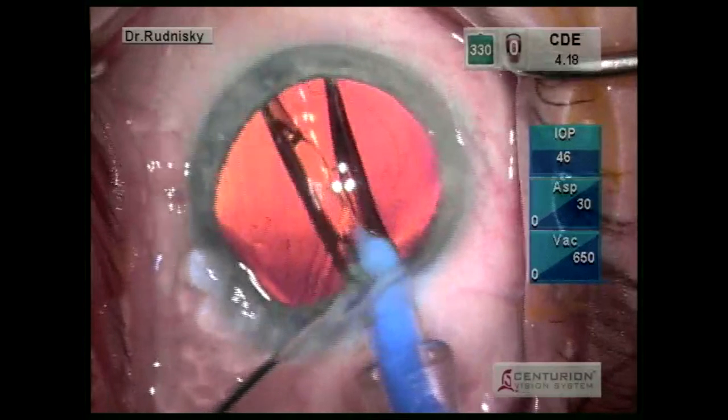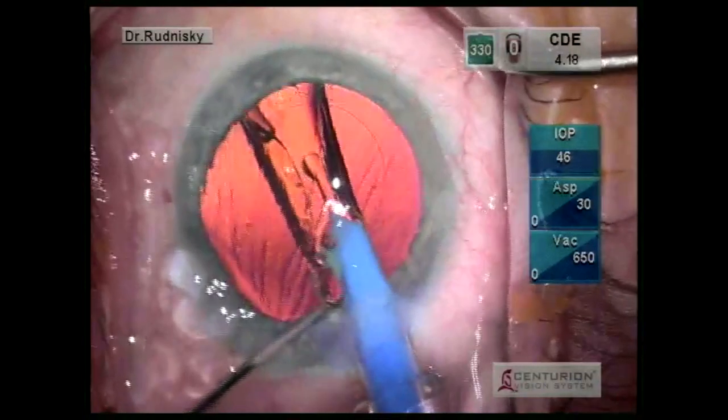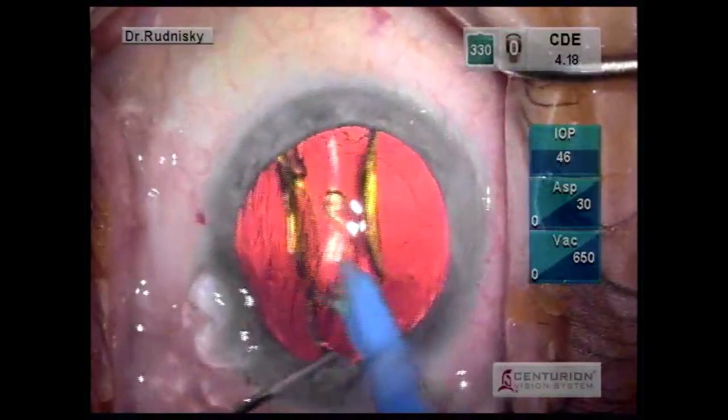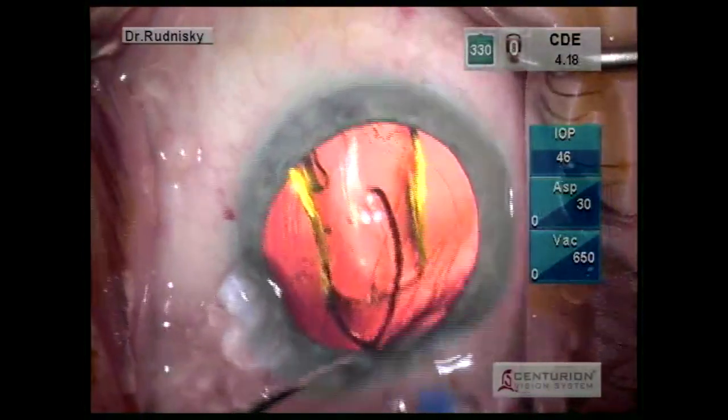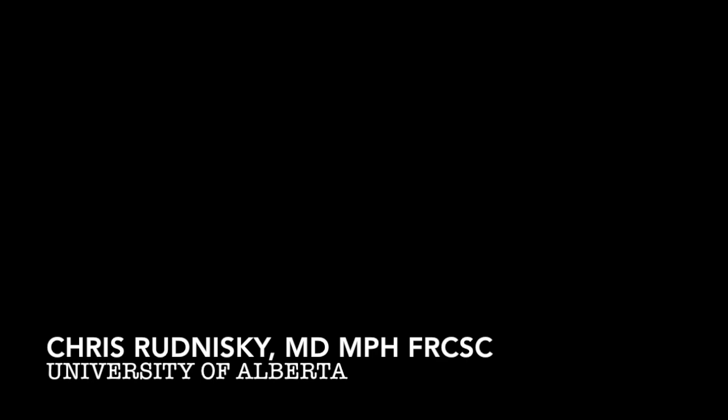Let me just slow that down a little bit. The key here is after you've inserted it, you turn the injector in a clockwise fashion — the idea being that you're twisting the optic away from the haptic. I hope that works for you. Good luck!